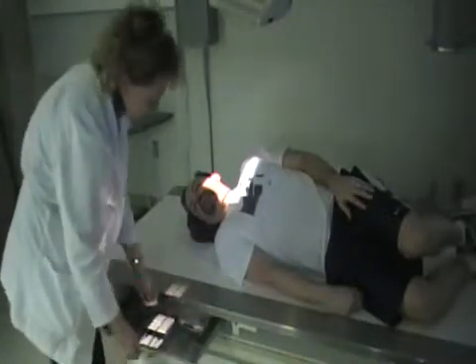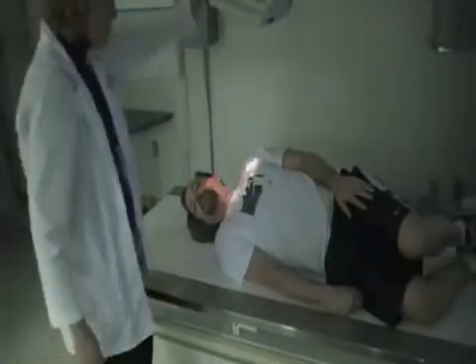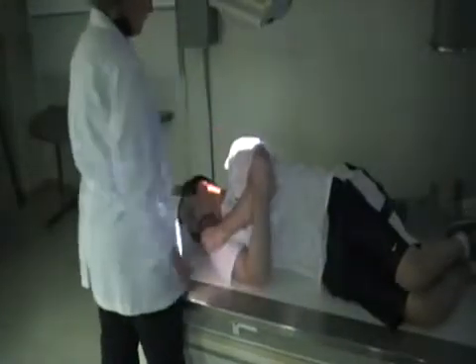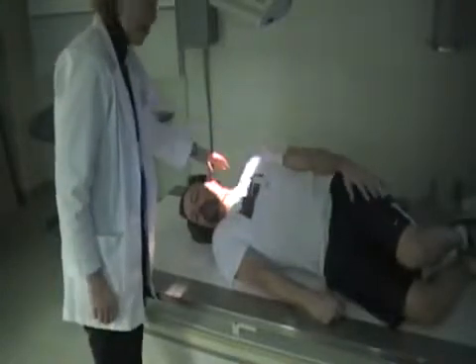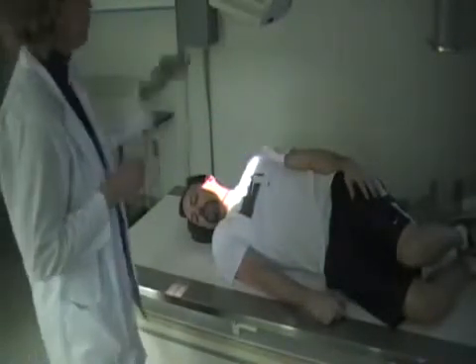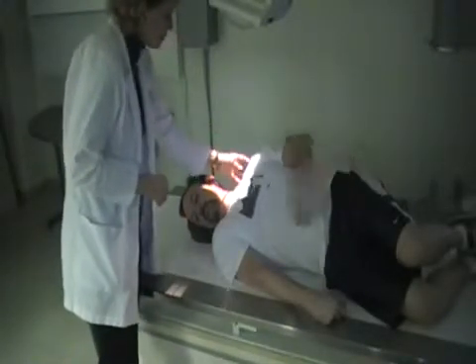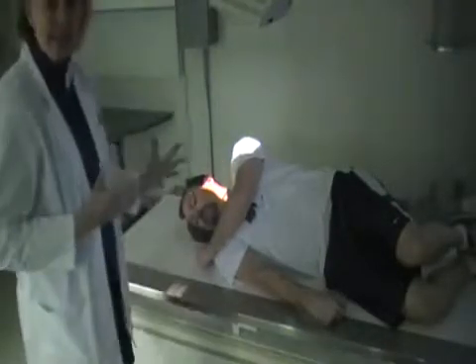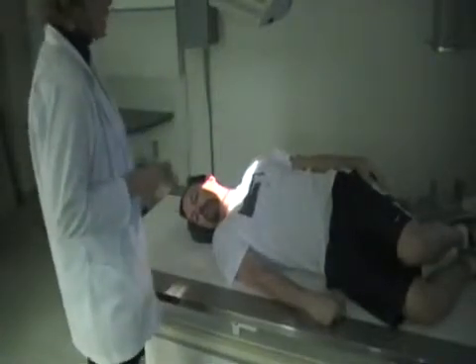One other thing you should check when you're doing these obliques is oftentimes a patient will want to roll up this shoulder, and you got to watch out for that, because that shoulder will be right in the beam and it's not going to make a very pretty image. So make sure that this shoulder is back, because you don't want to see this shoulder and there's the shadow right in the middle of his neck. That would be a major problem in your image. So make sure that this arm is back.